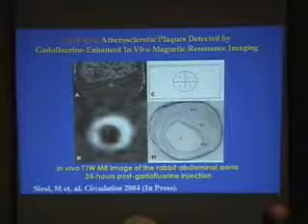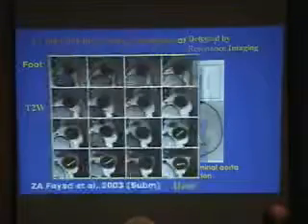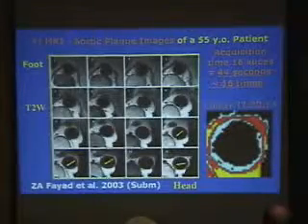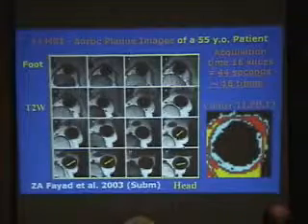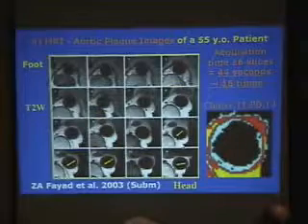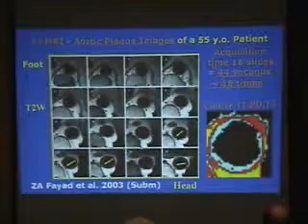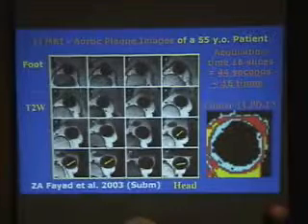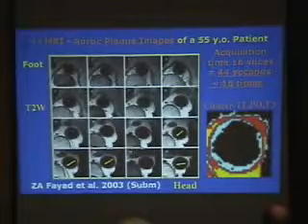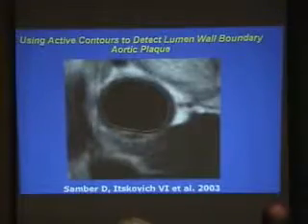However, even the plaques without injecting anything are becoming much more reliable in terms of sensitivity and specificity. Let me give you an example. We are now scanning the whole aorta. About a year ago, it took a couple of hours with the patient scanning and 24 hours of processing. Today, you can do everything in 1 hour, just a year later, by how you process the images with MRI, simply working on the software. This is thanks to Dr. Zahi Fayad. And this is when we do burden of disease quantification.